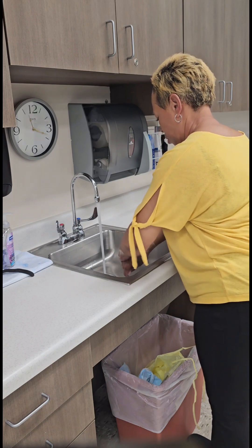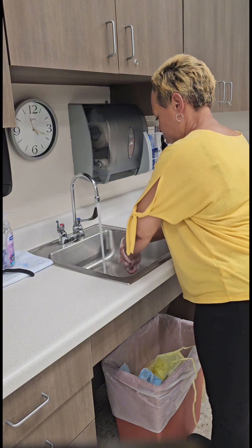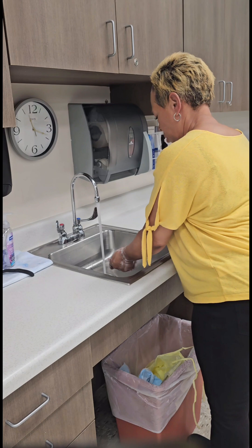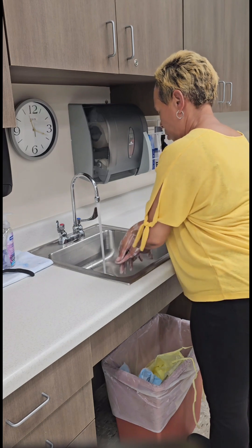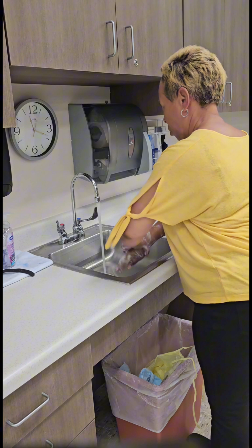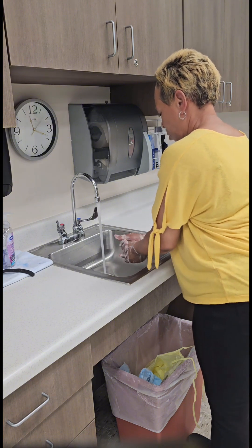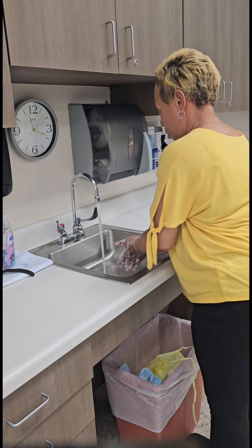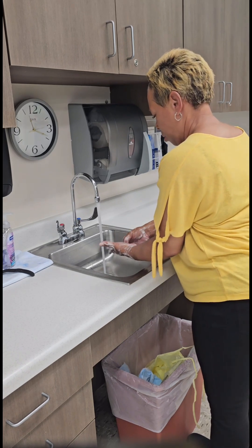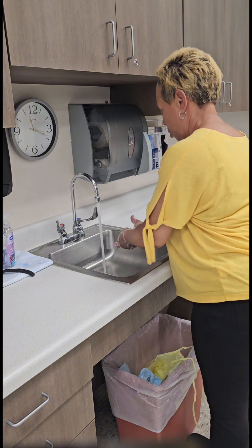Using the storm count — 1-1000, 2-1000 — or 3-Mississippi, 4-Mississippi — will ensure that you lather your hands for at least 20 seconds. After lathering your hands for at least 20 seconds, clean underneath your fingernails by rubbing your fingertips against the opposite palm.